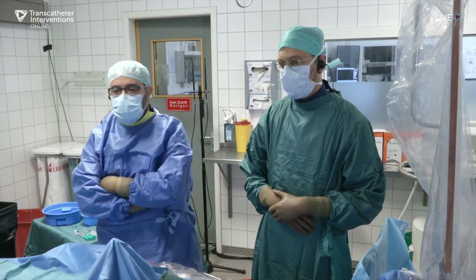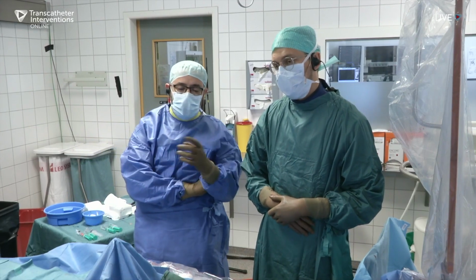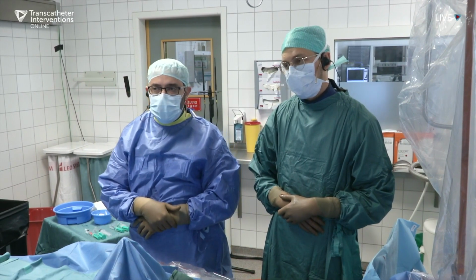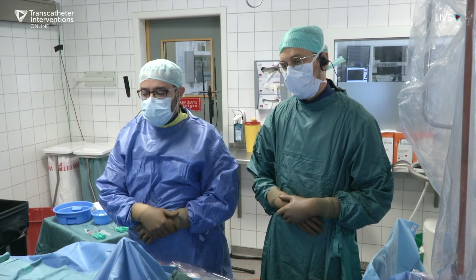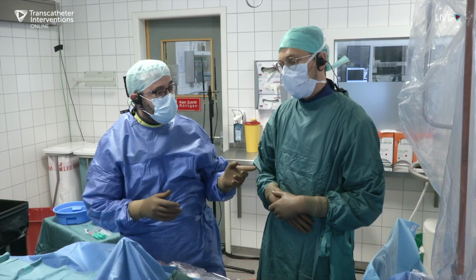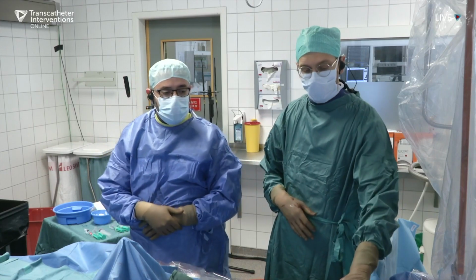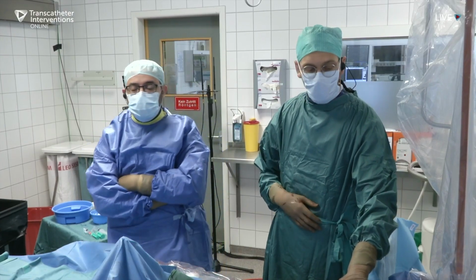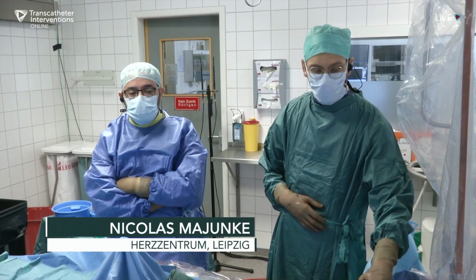This is the summary of the case, and I'll hand over to Nico, who will tell you about our strategy, how we're going to tackle this case, and meanwhile you can, of course, discuss and ask us questions. Nico, would you want to talk about the setup and what we're planning to do? Thank you, Mohammed. Hello, everybody. Let's talk about the setup first.